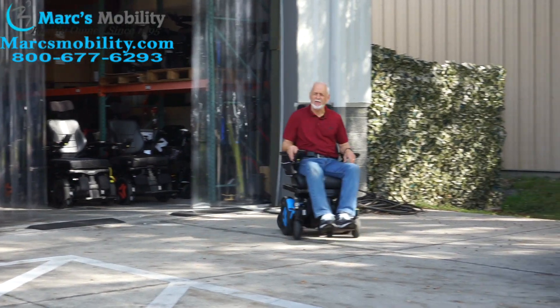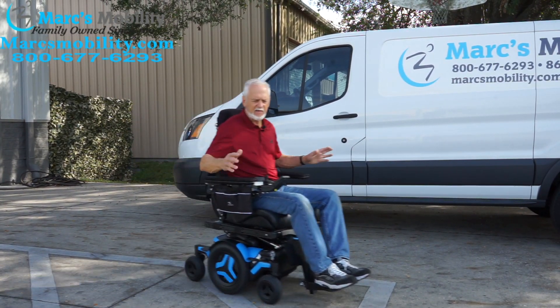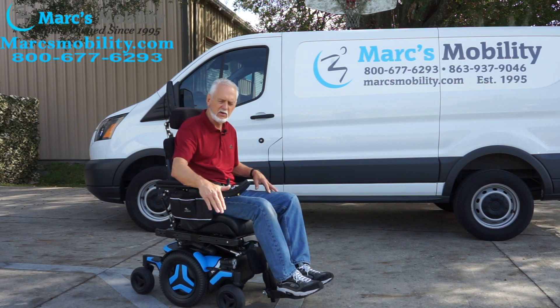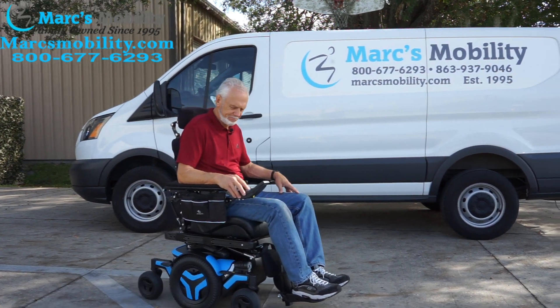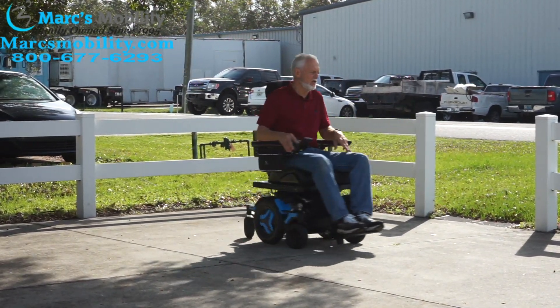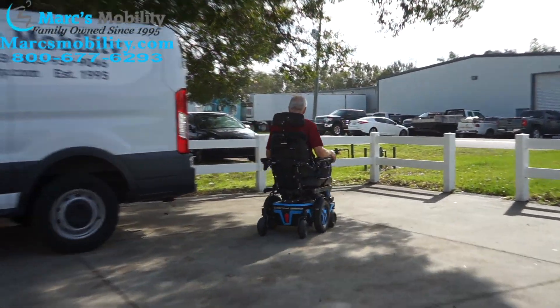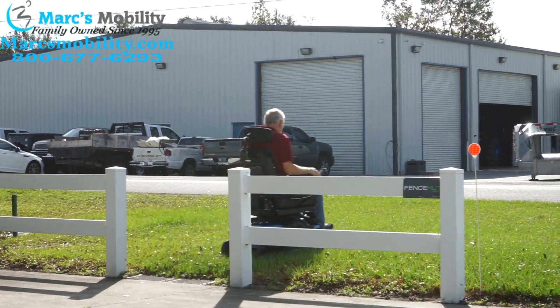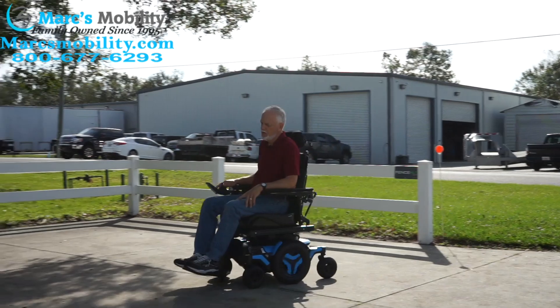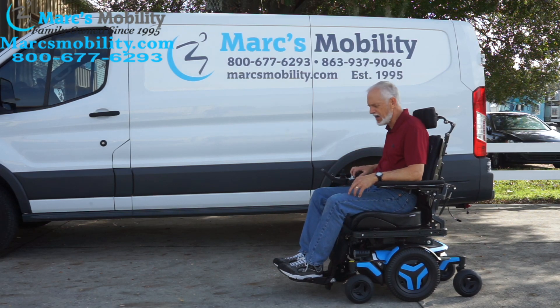This is a fast power chair — I didn't realize how fast. It hits 6.3 miles per hour. When you let go of the joystick it stops automatically because of built-in motor brakes — you could stop this in the middle of a hill and not roll down. You can feel how high quality this chair is. Here you can see how easily it goes through grass — as long as the ground isn't soft or sandy, you should have no problem.